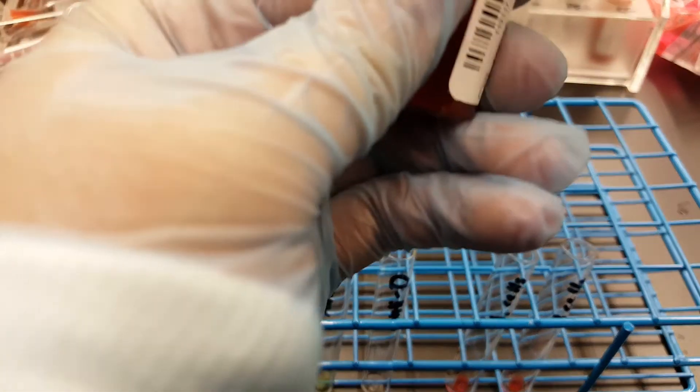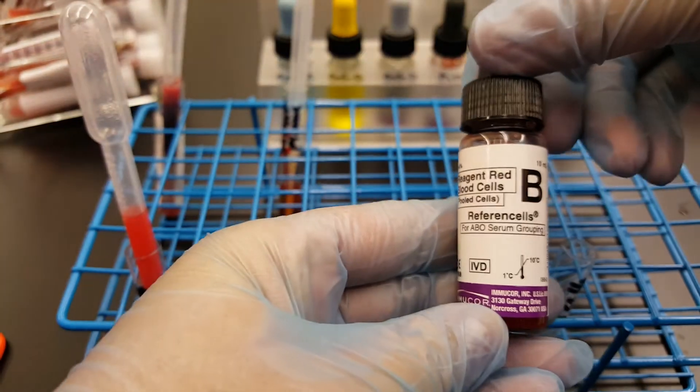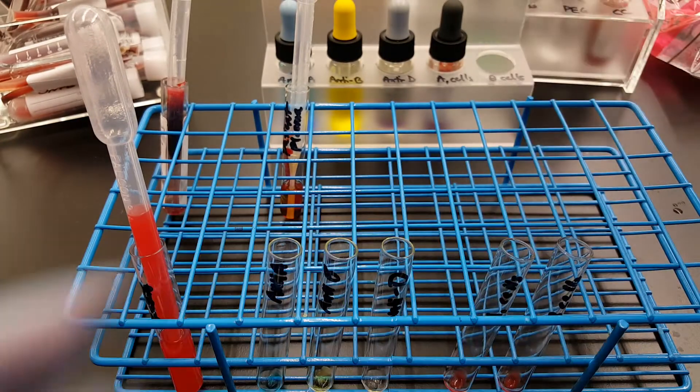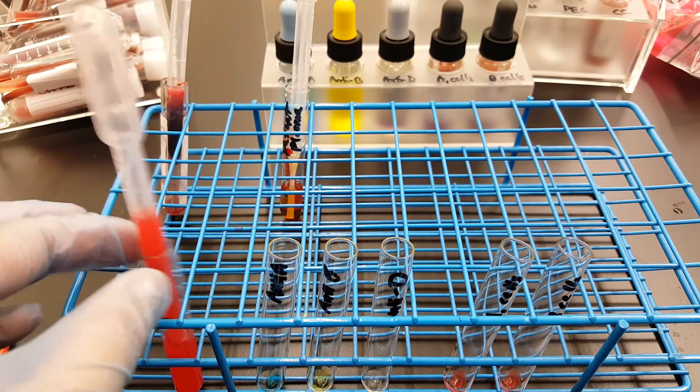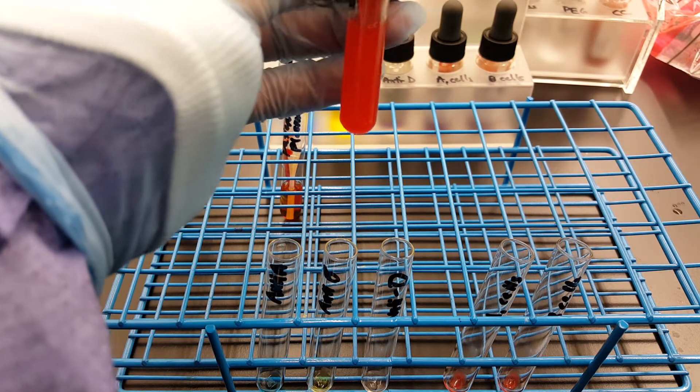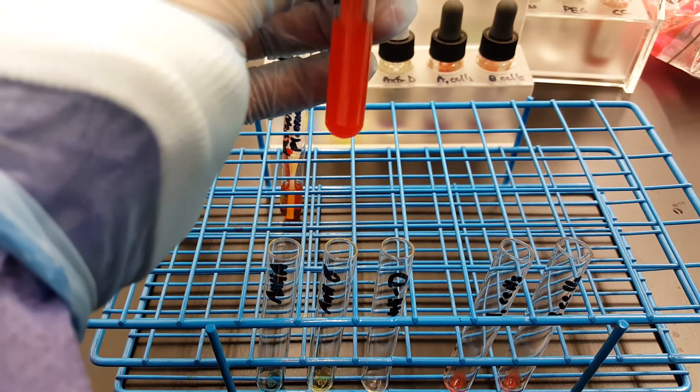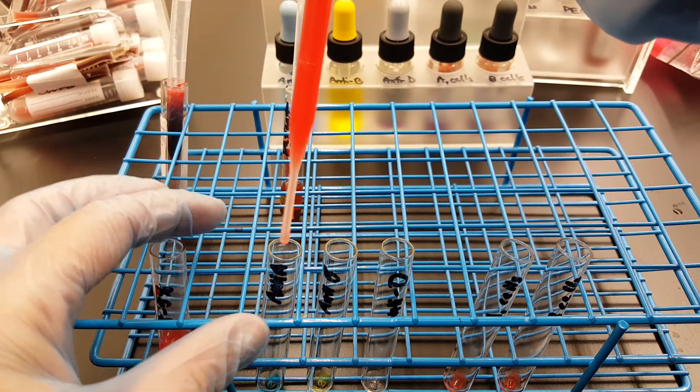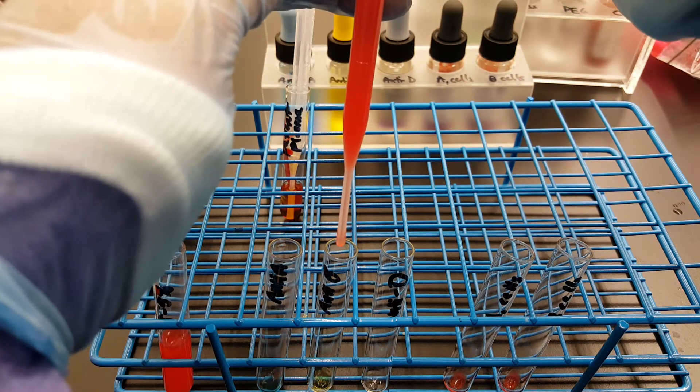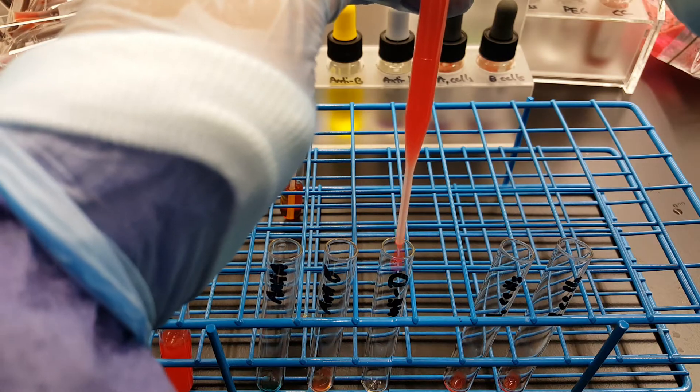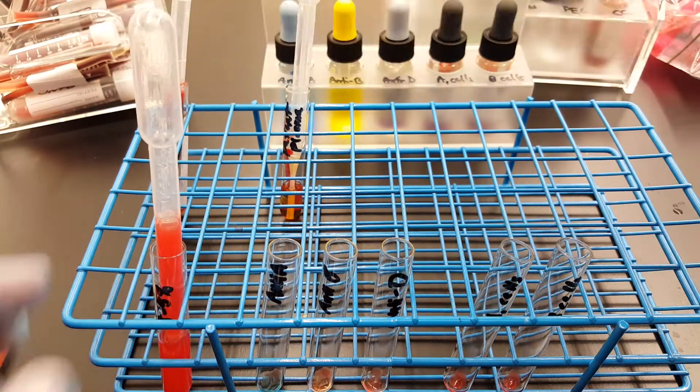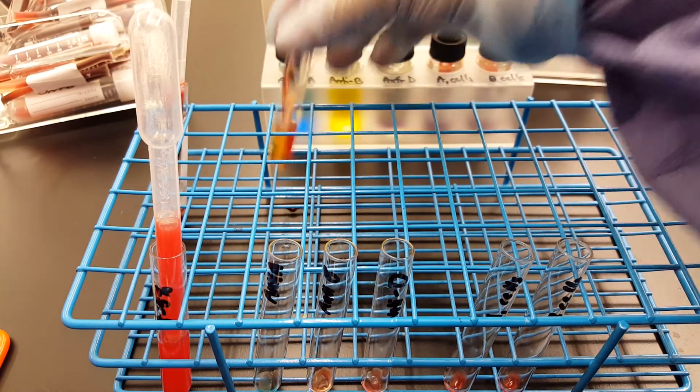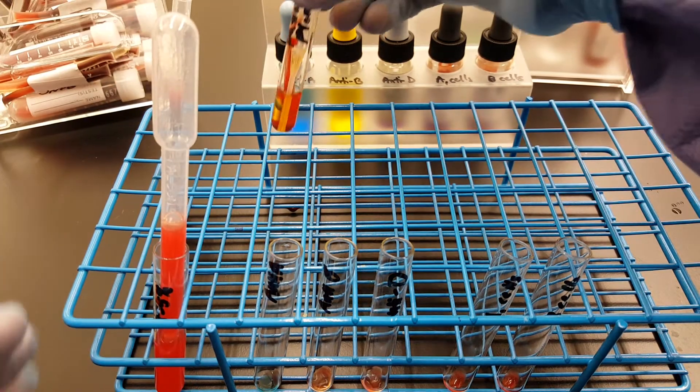Okay, so that's one drop of all the reagents—this was the B cells—and what we're going to do now is add the red cells, one drop of the patient suspension red cell suspension to each of the tubes. Okay, so only the forward typing tubes.